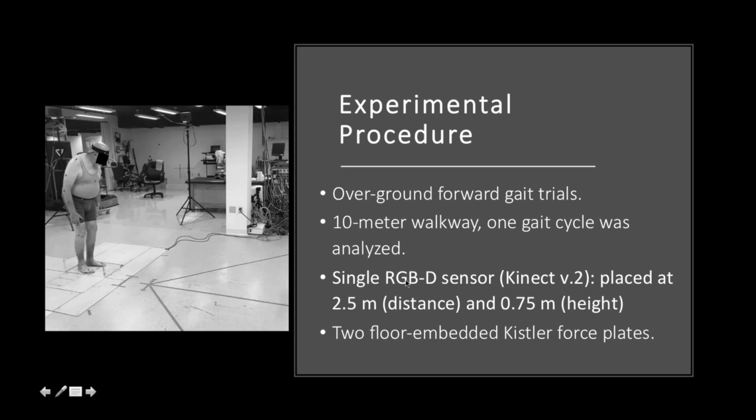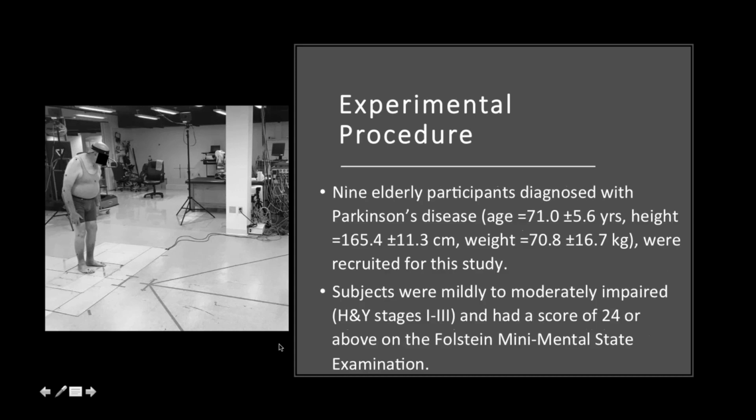We used a single depth sensor, which is very important, that I keep saying single, and I'm going to mention why. That was placed at 2.5 meters from the patient, and 0.75 meter from the ground. And we used 2 floor-embedded Kistler force plates.